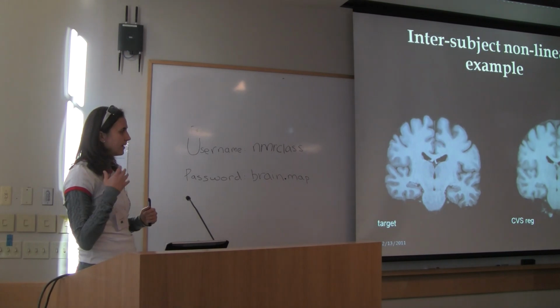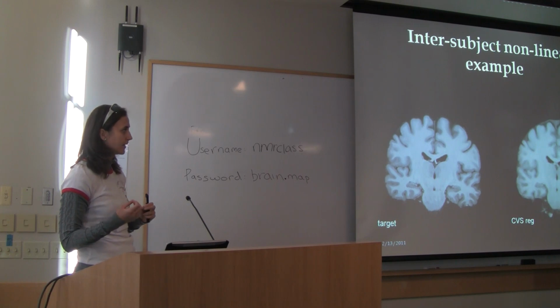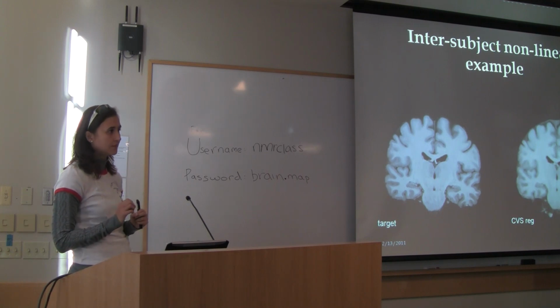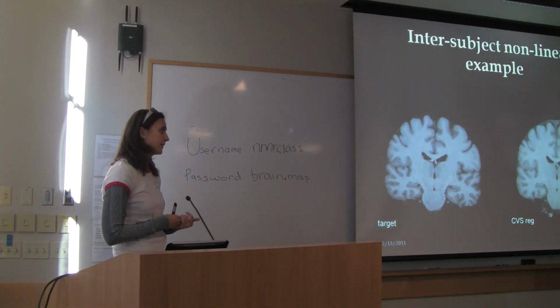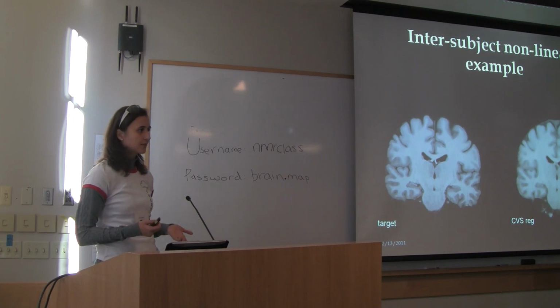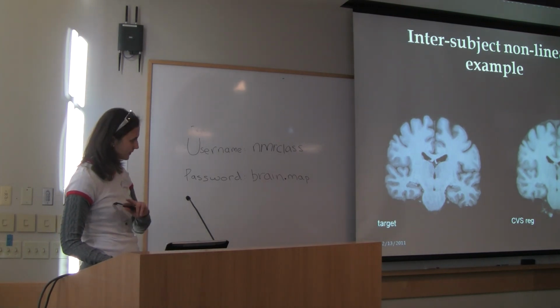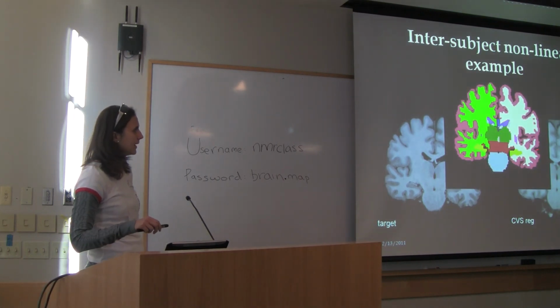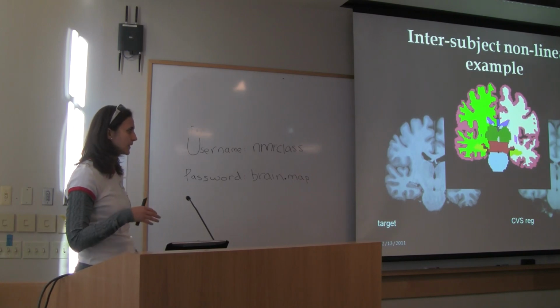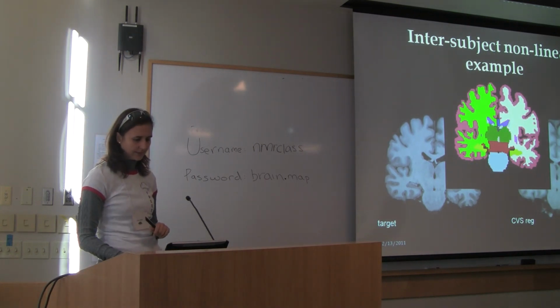This is a higher complexity registration that morphs your image and gets a much higher accuracy of correspondence between your images. So depending on what application you want to use or what kind of comparison you want to make between your subjects, you might need a much higher, much more local correspondence between your input data sets. So that's what I'm going to talk about on the third day of the course. And that's going to be very useful in order to map both cortical and subcortical labels from one subject or an atlas to the rest of the population that you are analyzing.